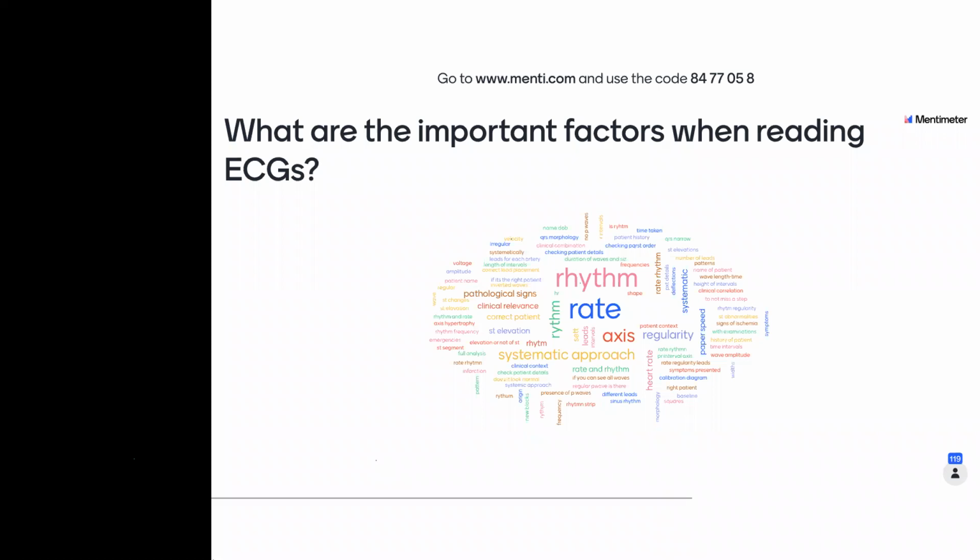So if somebody has got, for example, an SVT or any tachyarrhythmia that is over 160, 170, that we think is a narrow complex tachycardia or a broad complex tachycardia such as ventricular tachycardia, and they have any adverse features, what we will do with the defib is use the synchronized button, so that when you give an electrical shock, you give a synchronized DC cardioversion.